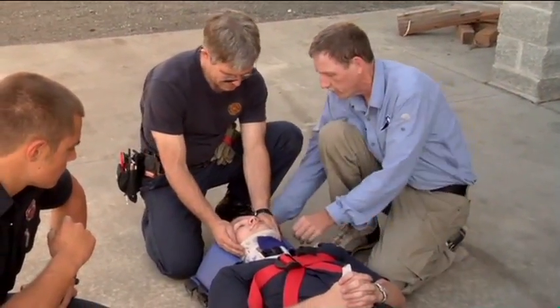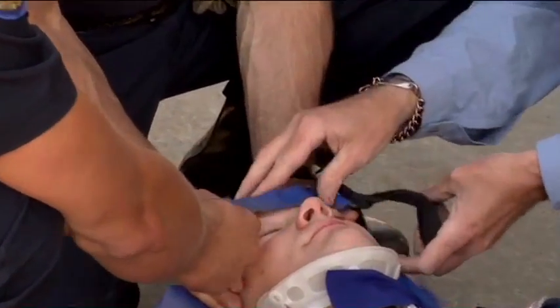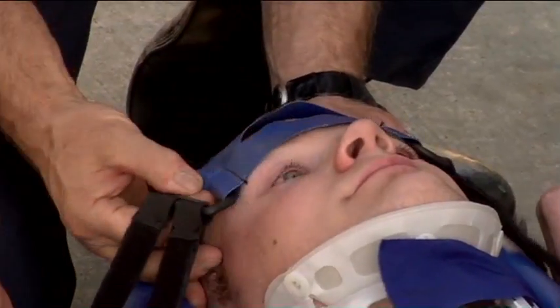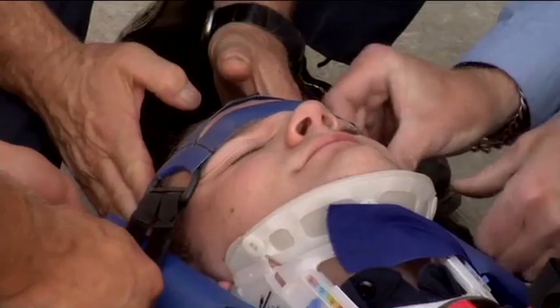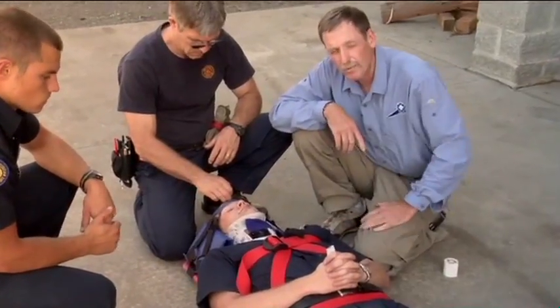The very last thing that we can do is go ahead and affix the forehead right across the supraorbital ridge, right here. That's your landmark. And you can use tape, you can use Velcro, doesn't really matter. Go ahead, pull. And now the patient is firmly affixed to the board with very strong attachment points.